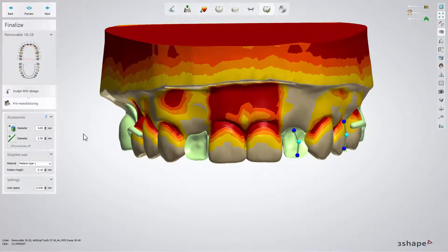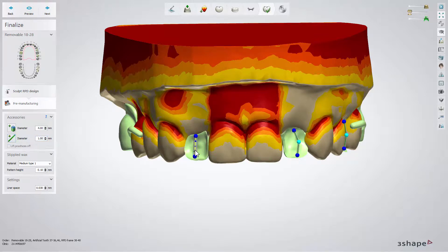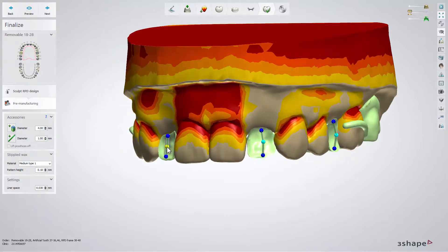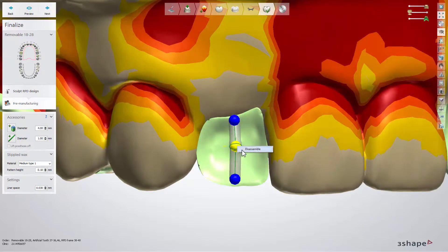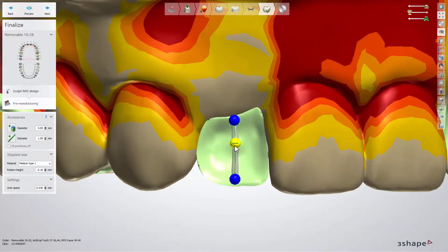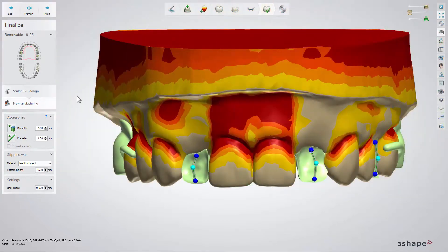In the pre-manufacturing step, you can make a retention on the facial surface of the Pontics for the acrylic. Choose the desired diameter of the support bars and place them parallel to the Pontics. Then right-click on it and choose the Split option. Adjust their shape and position, and when you are ready, click Next.